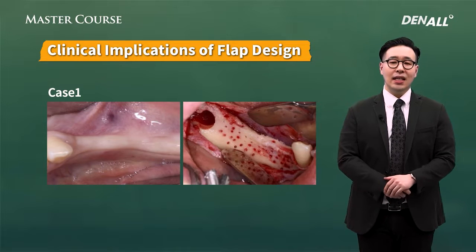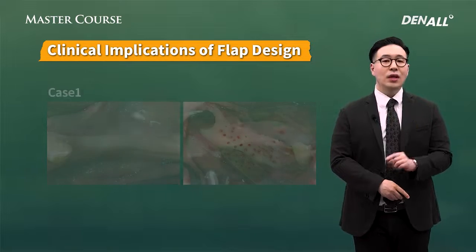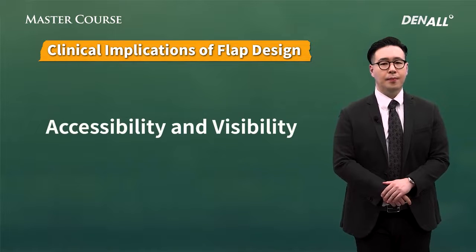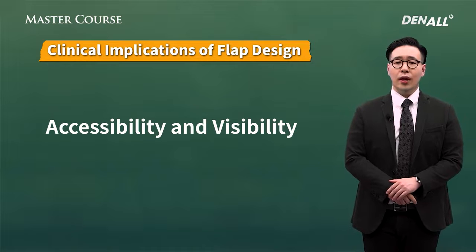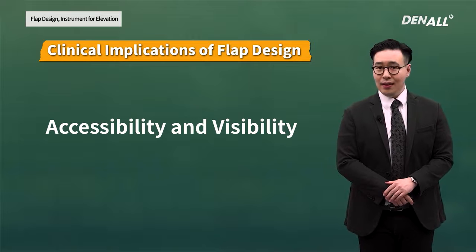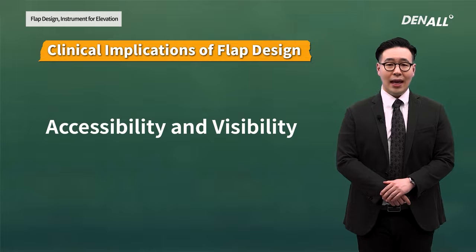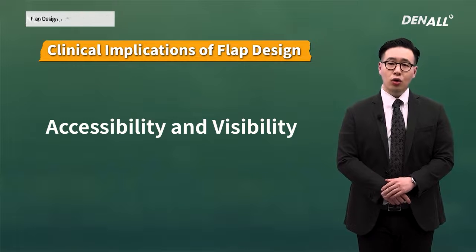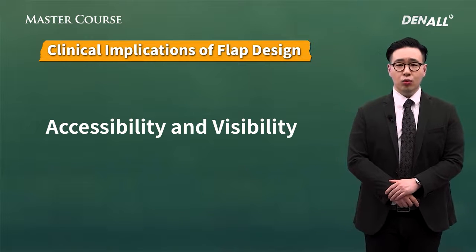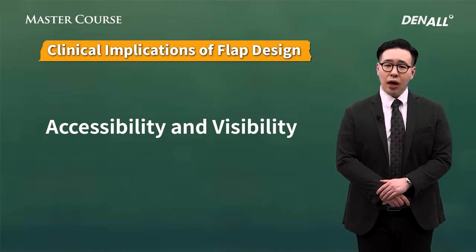The flap design and the clinical meaning it holds is directly related to visibility and accessibility. You can access specific surgical techniques through many clinical literature and seminars, but if you're a novice, there's a difference between what you know and what you can do. And I think the reason is directly related with visibility and accessibility.